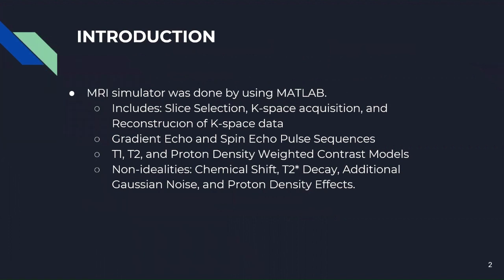Before going further, I want to give a brief information about MRI. Magnetic resonance imaging, MRI, is a type of scan that uses strong magnetic fields and radio waves to produce detailed images of the inside of the body. So in the scope of the project, the MRI simulator was done by using MATLAB.